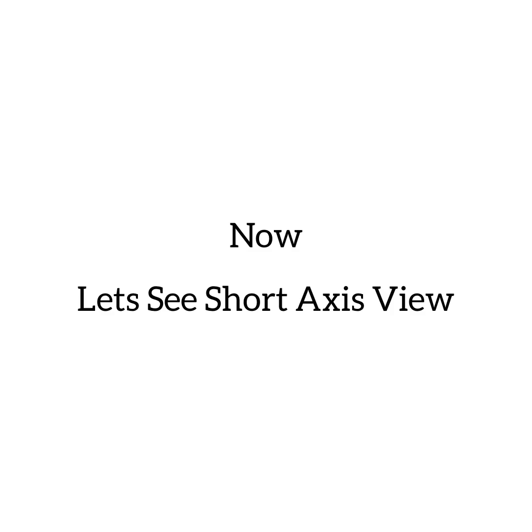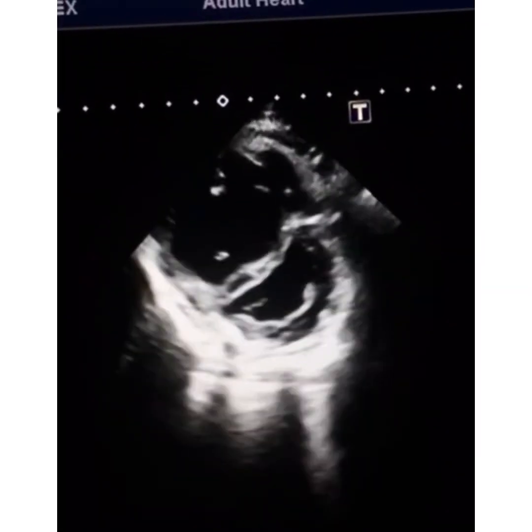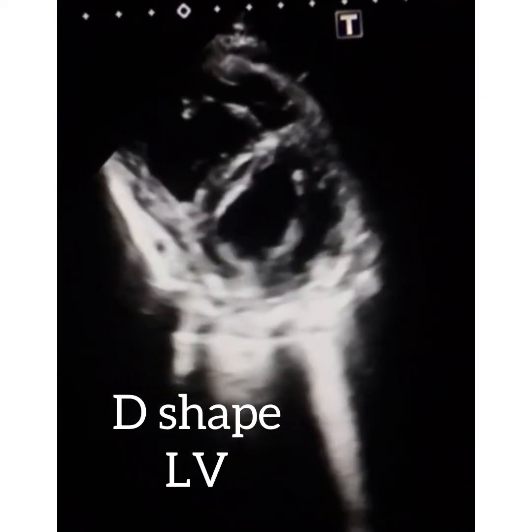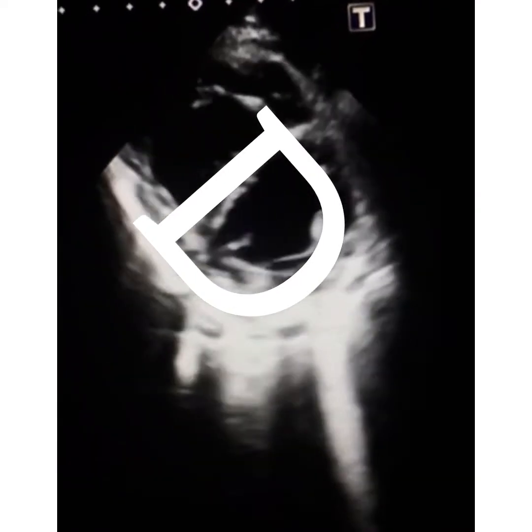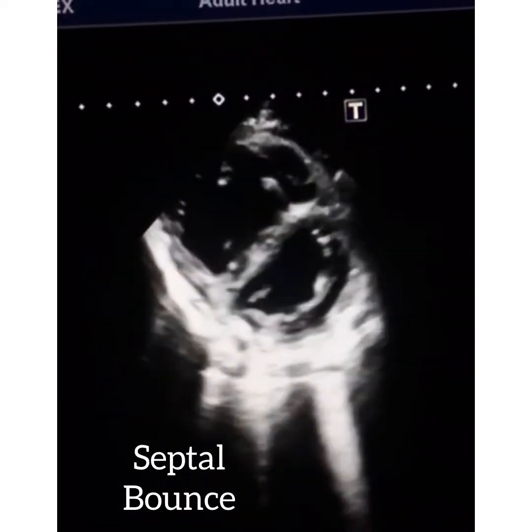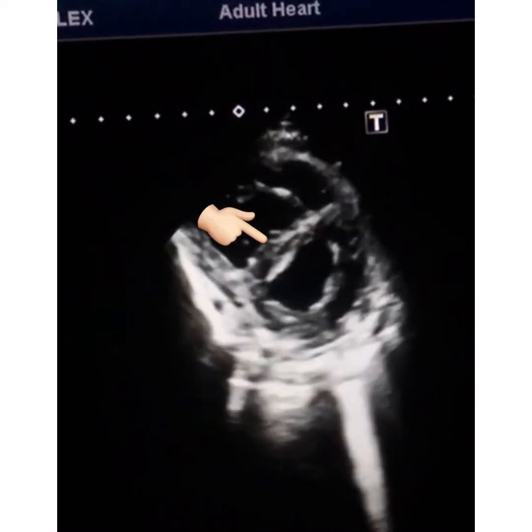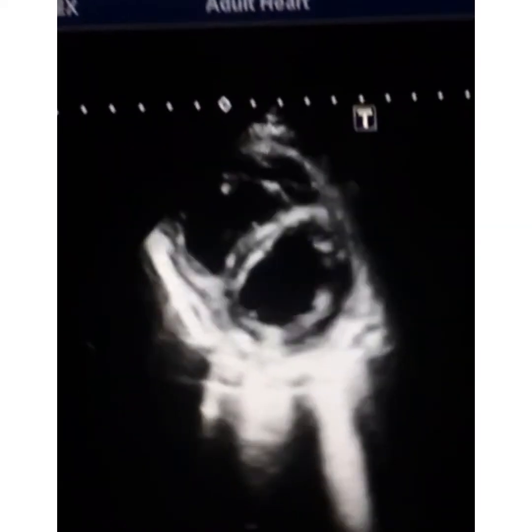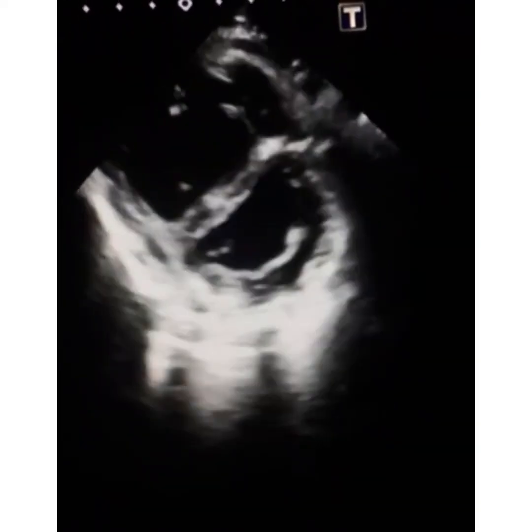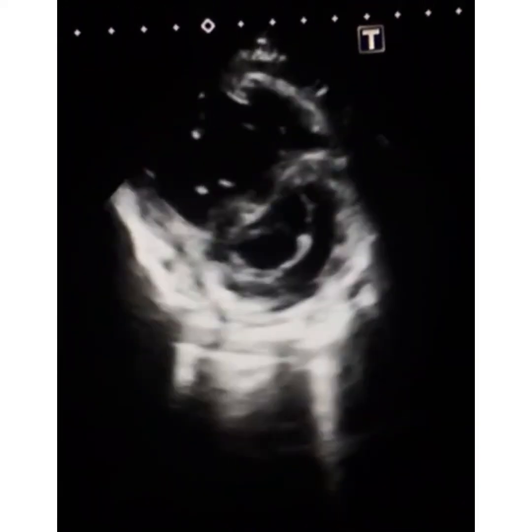Now let's see the short axis view. In this view, you can see 2 points which are supporting constrictive pericarditis. The D-shaped LV, which is visible, and the other is septal bounce. You can see that the interventricular septum is bouncing in between the two ventricles during diastole with the change in the pressure. You can see clearly.